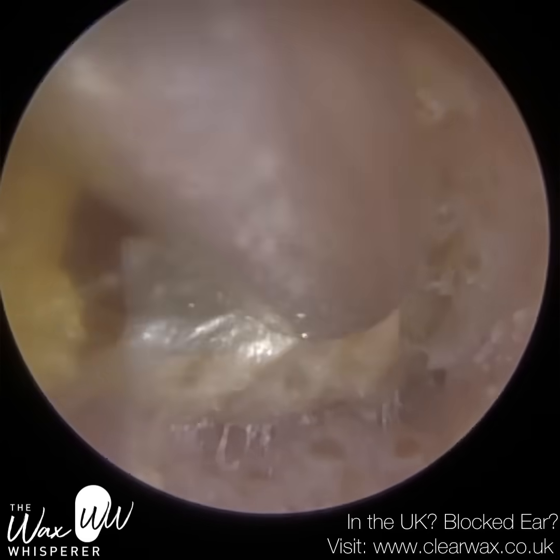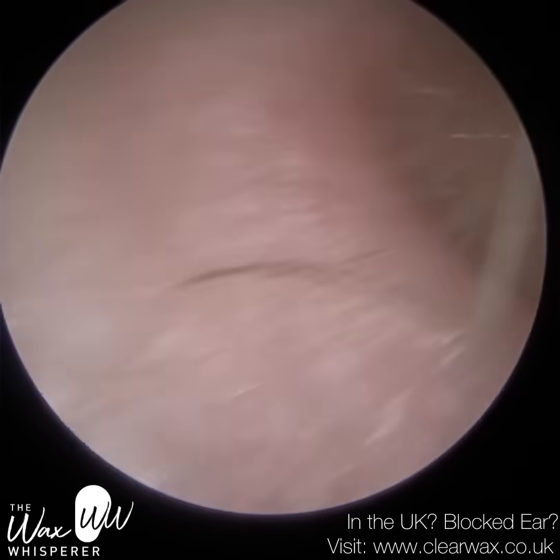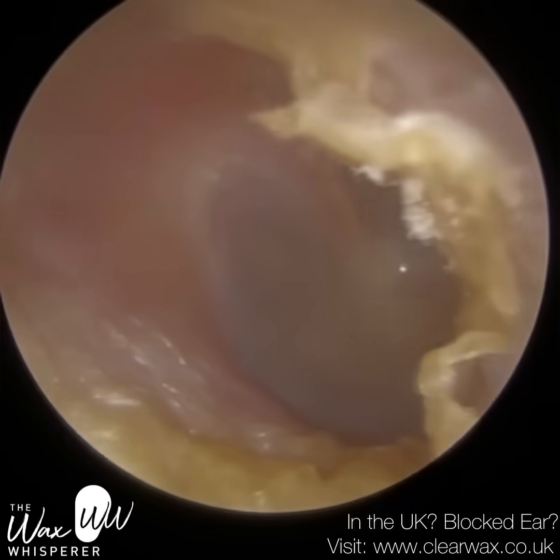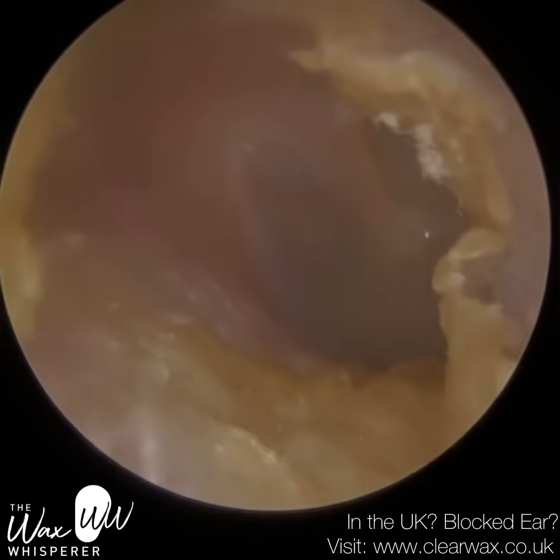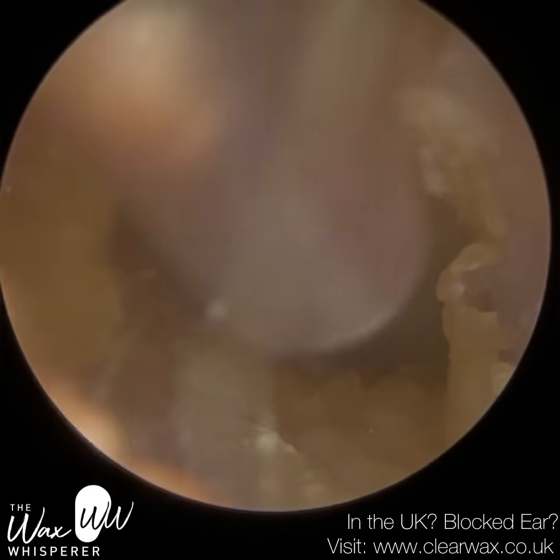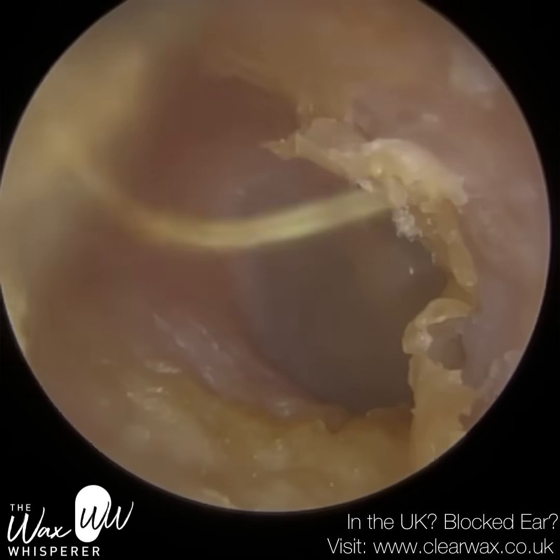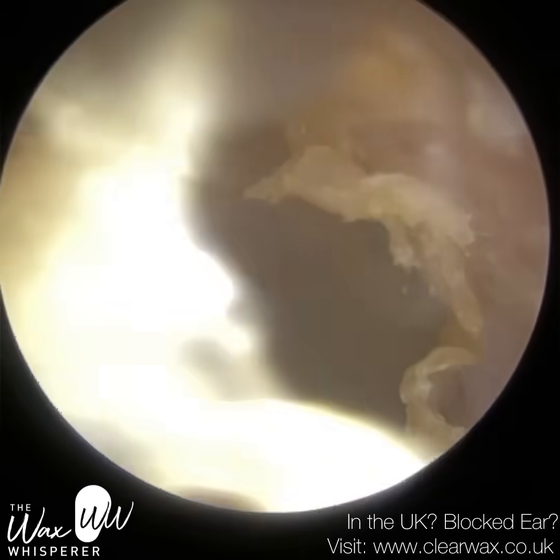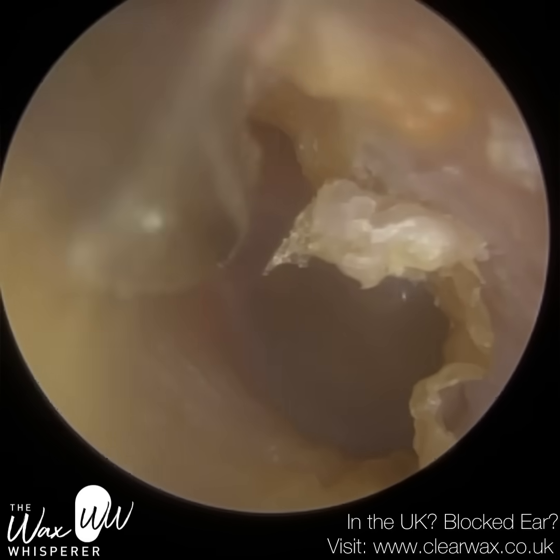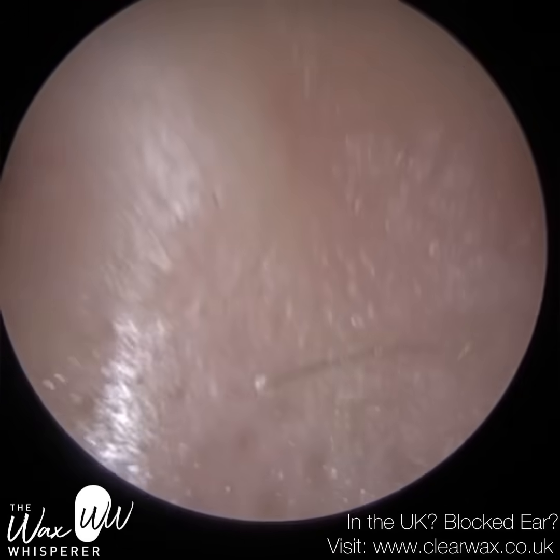I want to try and do this completely using dry instruments. I'm going to go back to the suction here — I just wanted to see if I can lift it off the canal wall a little bit and then go in with the forceps. I think I do go back in with the forceps. Sometimes you just have to position the skin away from the canal so you can glide the forceps in.